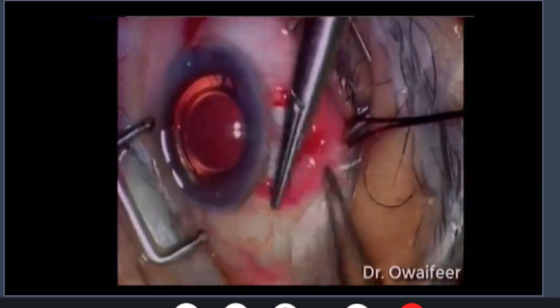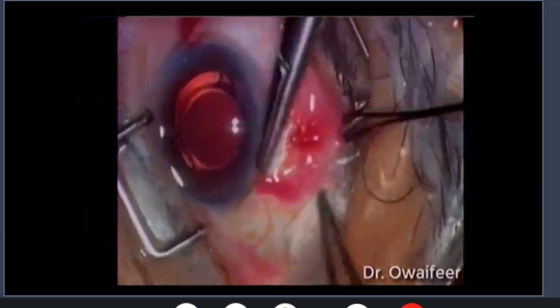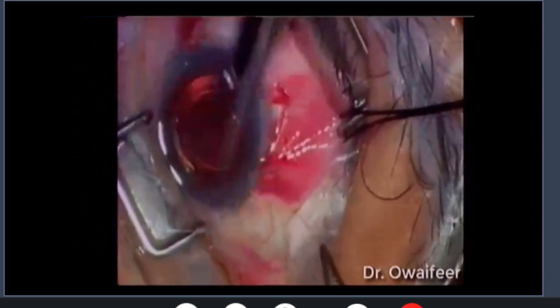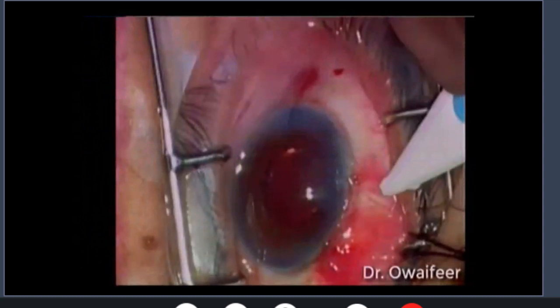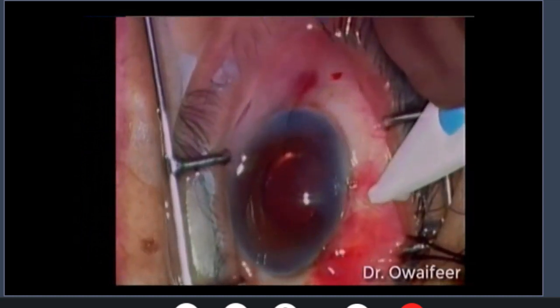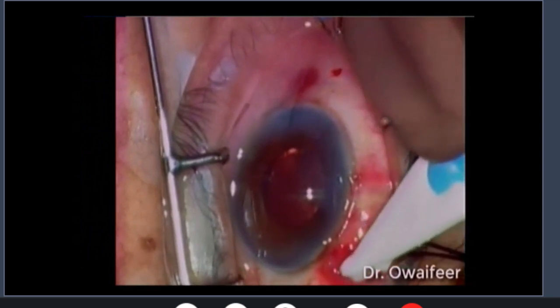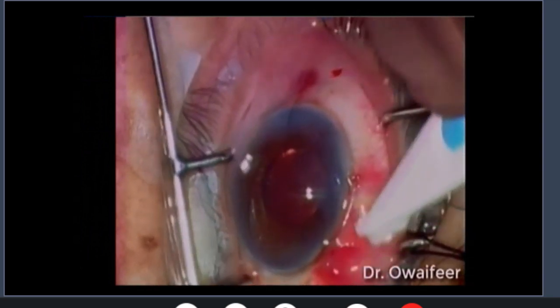and then finally you close the conjunctiva. And at the end, the favorite moment for any glaucoma surgeon at the end of a trabeculectomy is to test your bleb. You can see over here how the bleb nicely forms. This was 4 years ago, so I doubt that this bleb is still working.